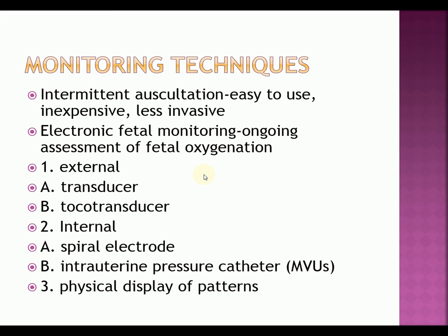Now that doesn't sound too bad, every 15 minutes or every 30 minutes to an hour. But by the time you listen to the heart rate before a contraction, listen to the heart rate during the contraction, and then listen to the heart rate for a period of time after the contraction, you've spent at least 5 to 10 minutes in there doing your one intermittent auscultation. So that's why nurses tend to like the electronic fetal monitoring better, because all they have to do is just glance at the monitor.